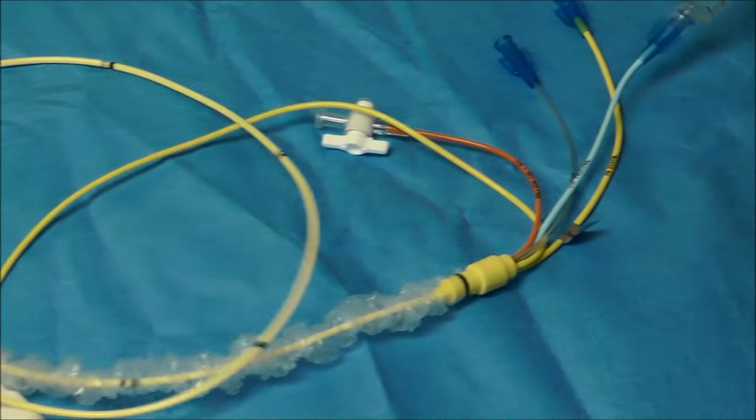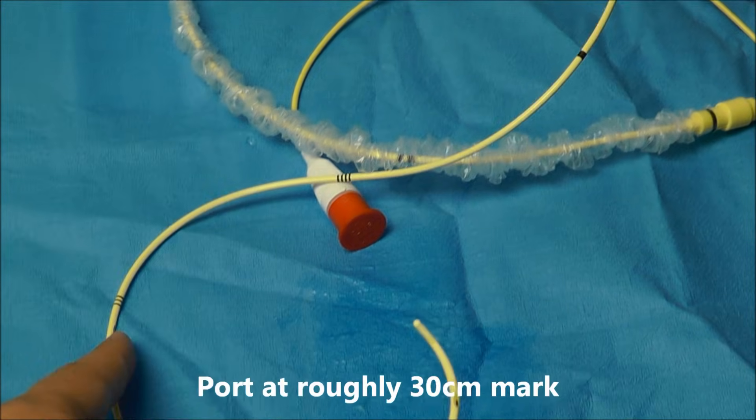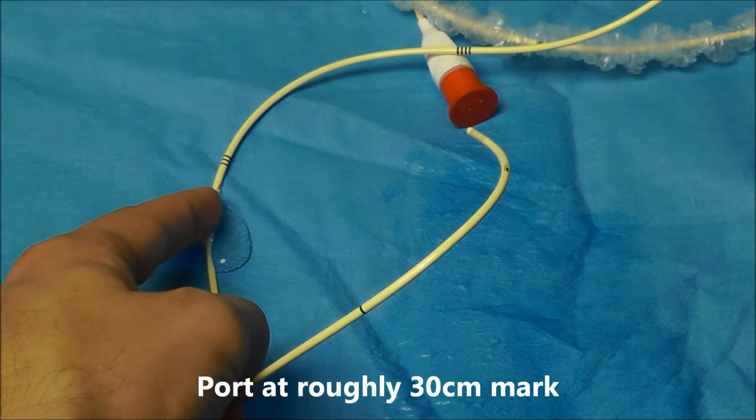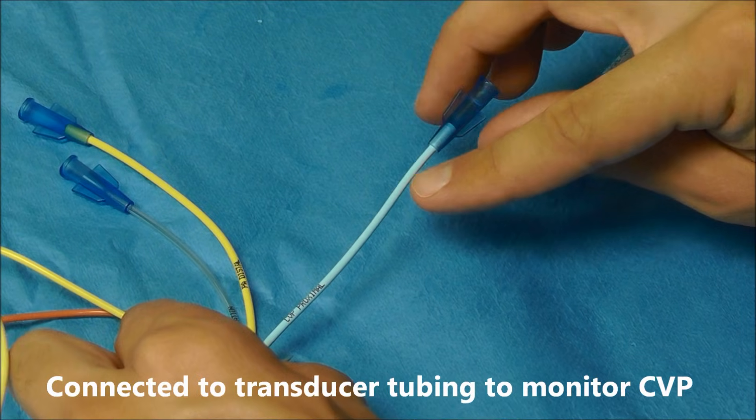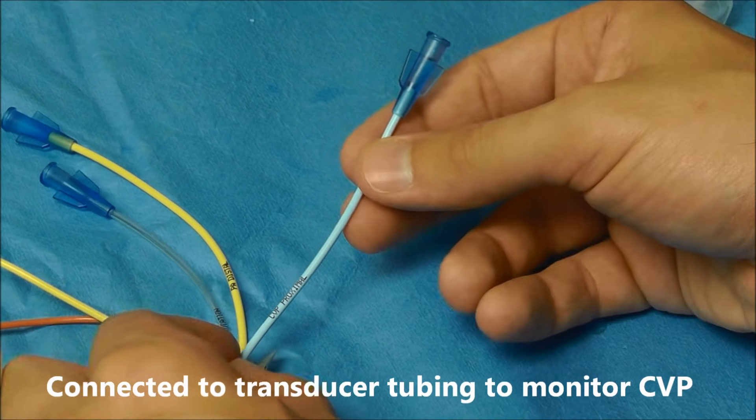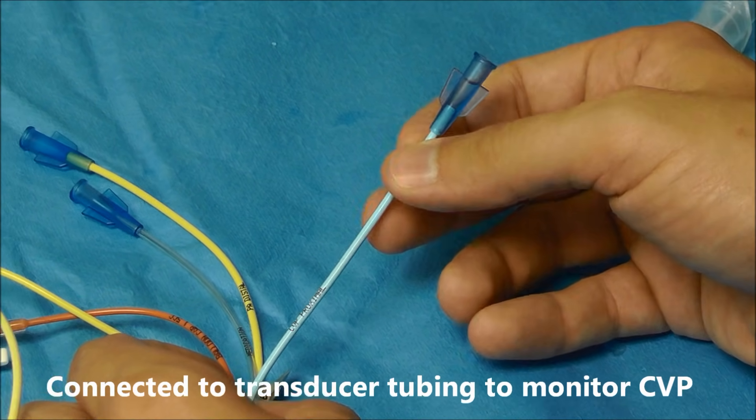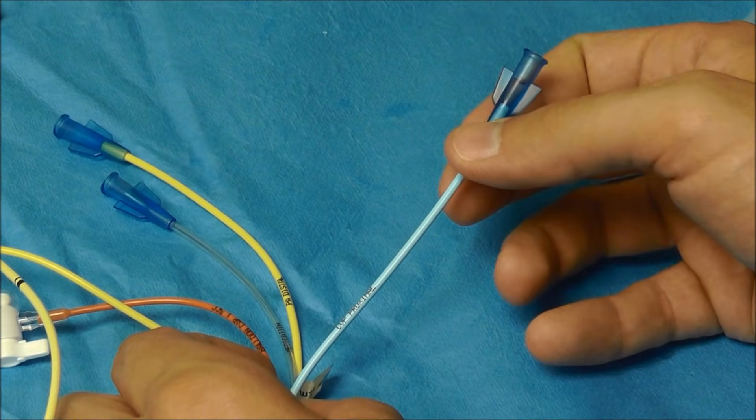And if you follow it all the way over here, you're going to notice that saline comes out of that port right there. We connect transducer tubing to this blue port here. And we use that to monitor central venous pressure.